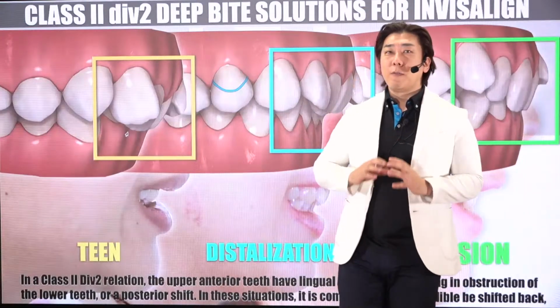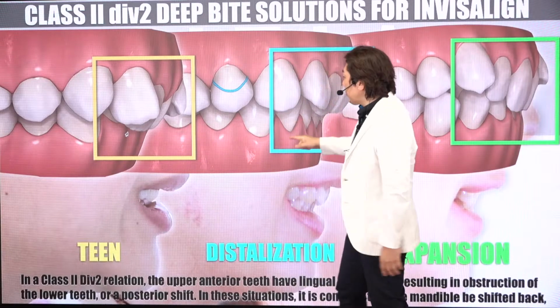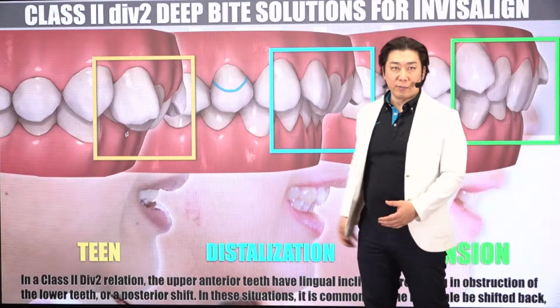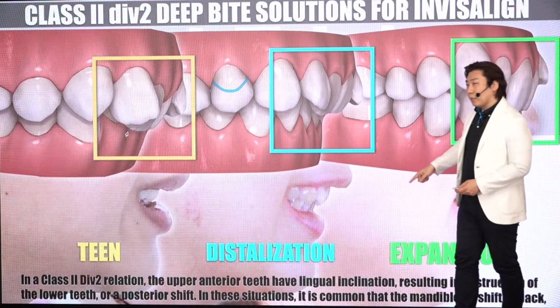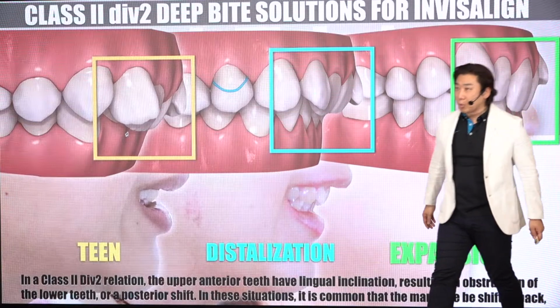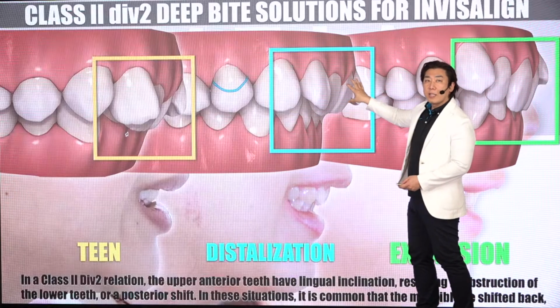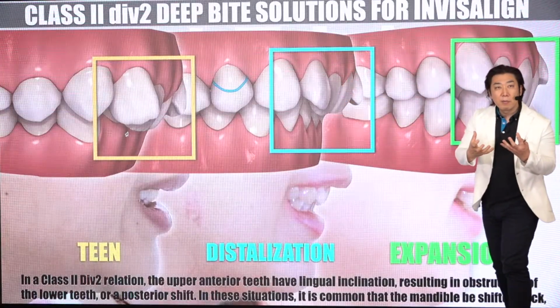If there is no pain and no functional problem, we initially start Invisalign planning, but in a situation like this where the mandible shifts to the back, how can we transfer it to the ClinCheck? This is a very important thing. Have a look: a teen patient, an upper molar distalization patient, an expansion patient. In all aspects, we have a very important thing. Initially, focus on this axis. This axis is the problem because on this axis the mandible will be back.